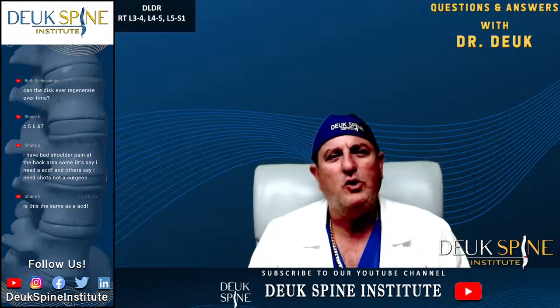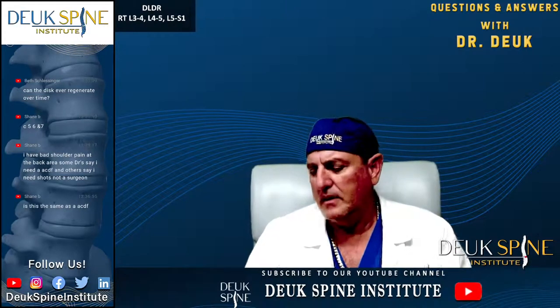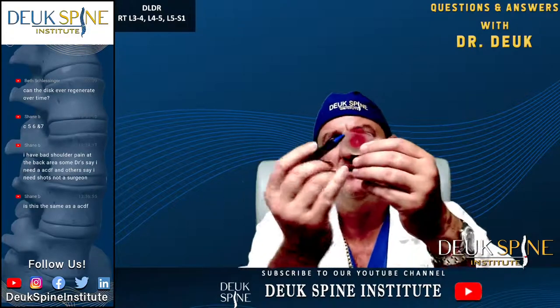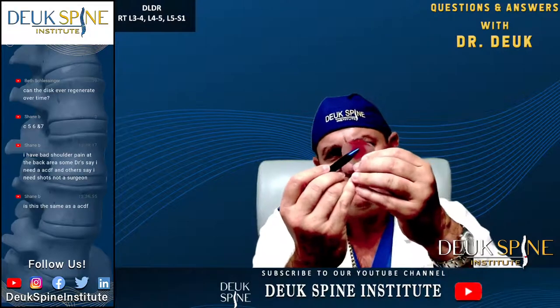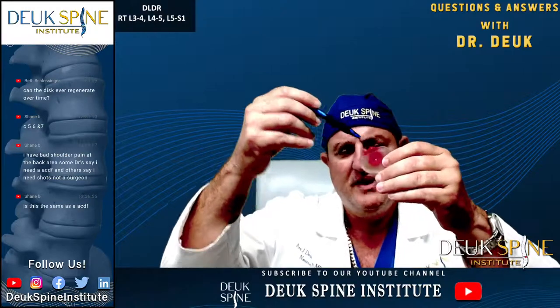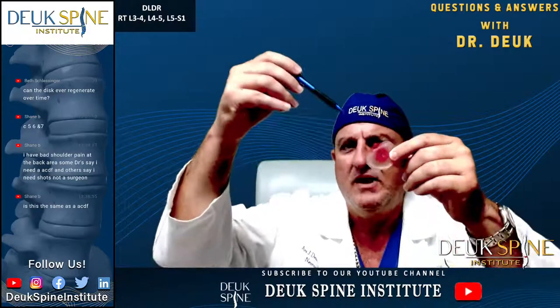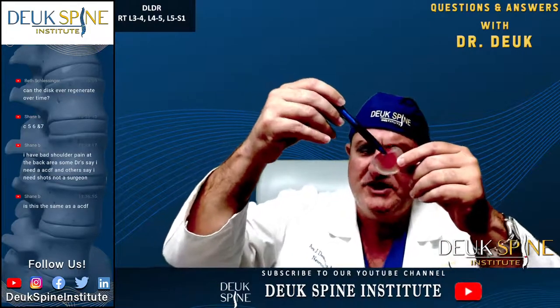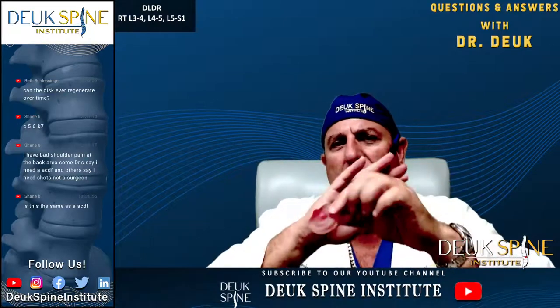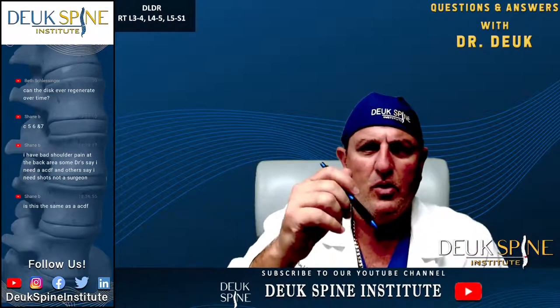Joe, we didn't put a hole in the disc with the endoscope. The hole was already there. It's called an annular tear. And I just got through talking about that, and no offense, but remember we talked about how people get an injury to the back of the disc, they get a tear in the annulus, and then through the tear comes a herniation. We didn't create any new holes. I went through an existing hole that's already there. And when I went in, I literally pushed the herniation back inside the disc, and we took it out from the inside. So we don't create holes in people's discs. The hole's already there.